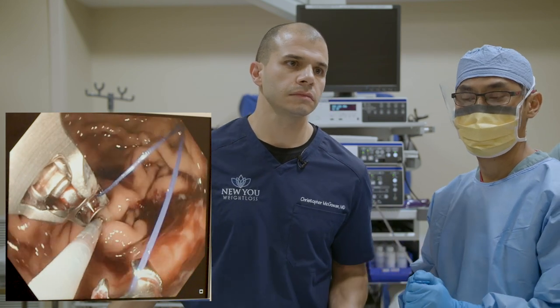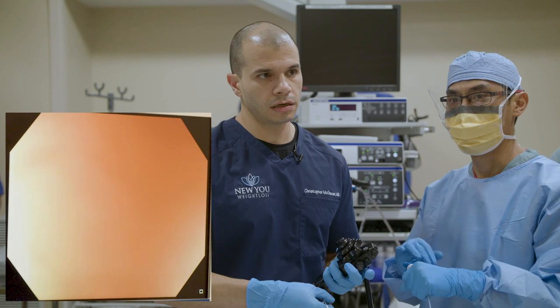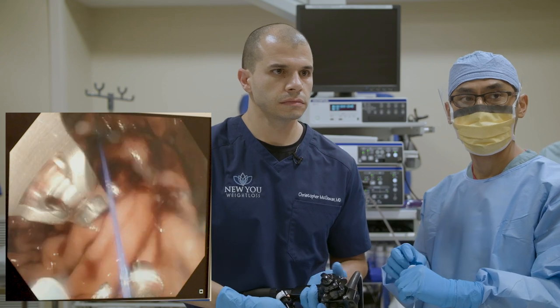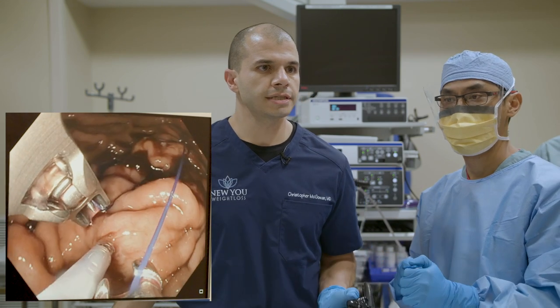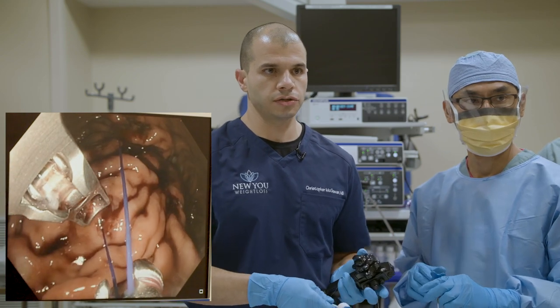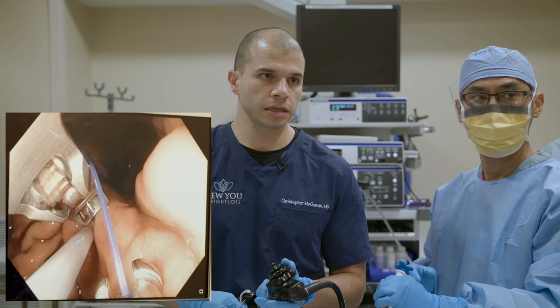Question from Tina: how many ESG procedures have you done? About 130 total at this point. Question from Thomas: can I have this procedure if I've had a gastric sleeve before? One of the procedures we perform pretty commonly is a sleeve revision — revising a surgical sleeve. It's a somewhat similar process: we're basically suturing the stomach to make it small again, since a surgical sleeve can stretch out over time. We'd call it a revision as opposed to a primary sleeve.